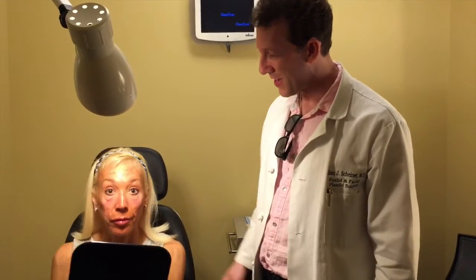So you can see the difference there now? Yeah. And so this is the way that we can dissolve hyaluronic acids. This happens to be in the lower lid area, but that same technique can be used for any place you use hyaluronic acids. A lot of times we'll use it for obstructions, vessels. So if you have it in the nasolabial fold, you can put the same amount in, you put it under pressure with tape. I find it drives it into the tissue a little bit better. And thank you very much for watching.